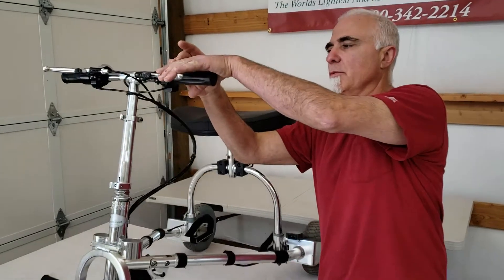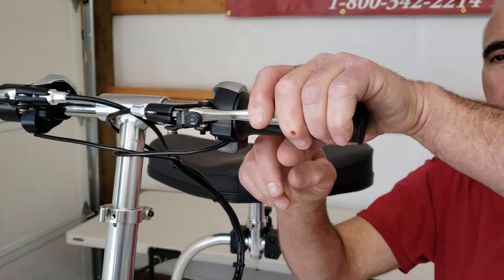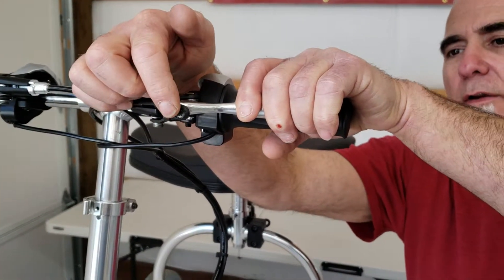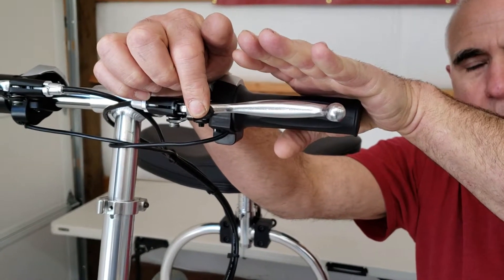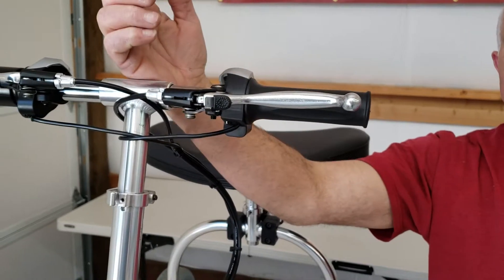The way this works is you simply depress the brake lever with one hand, and with your other hand, you push in the parking brake lock. While you're holding in the parking brake lock, release the brake lever. That's all there's to it.